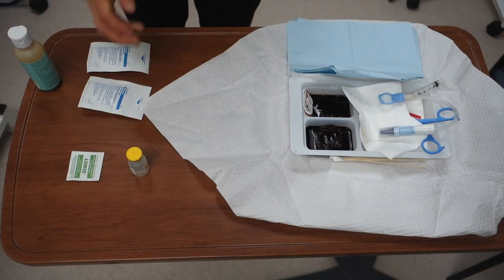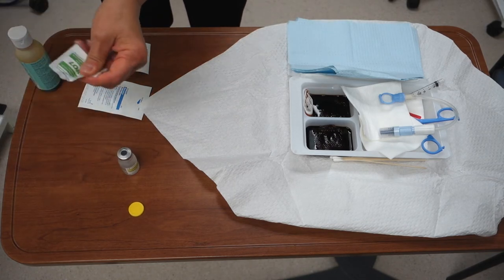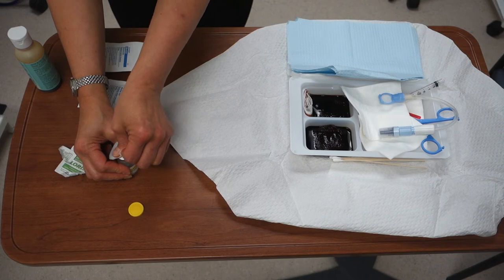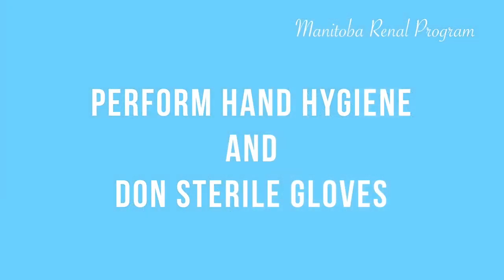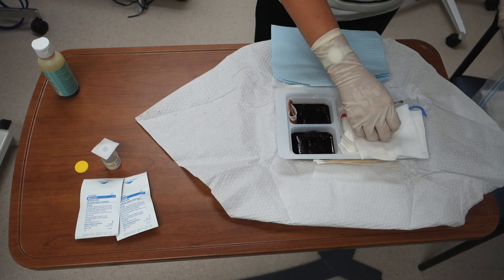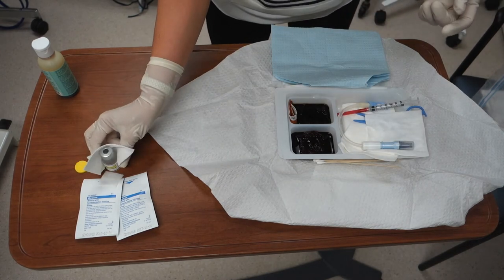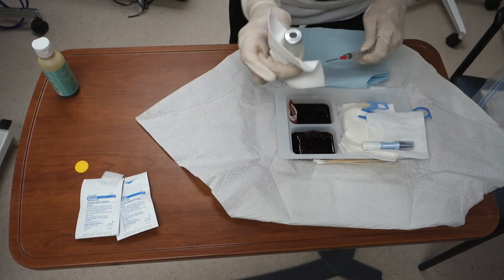Then you will wipe the top of the sodium chloride vial with an alcohol swab. Then you will perform hand hygiene and put on the sterile gloves. You will take a sterile gauze and draw up 3cc of normal saline. You will use this gauze to maintain the sterility of your gloves.